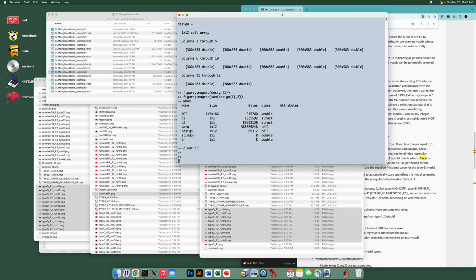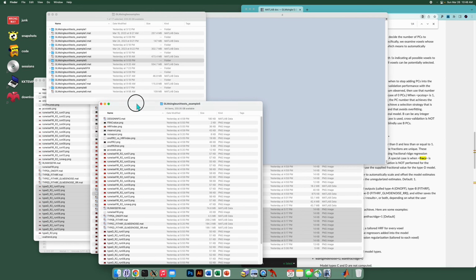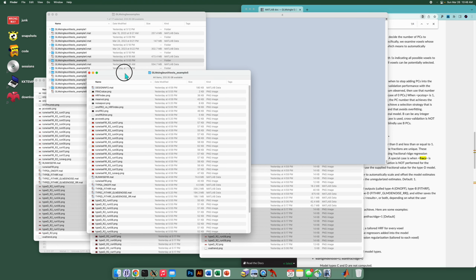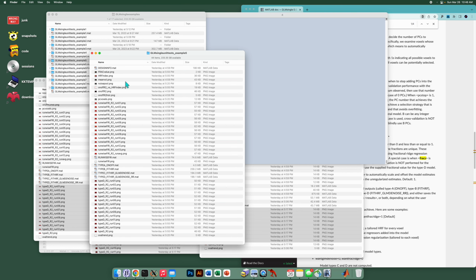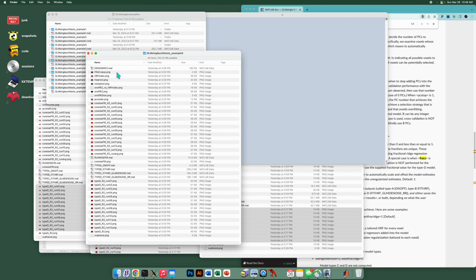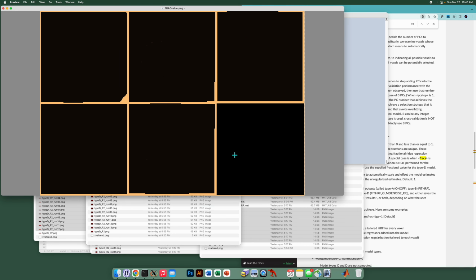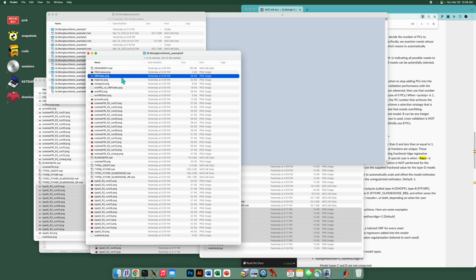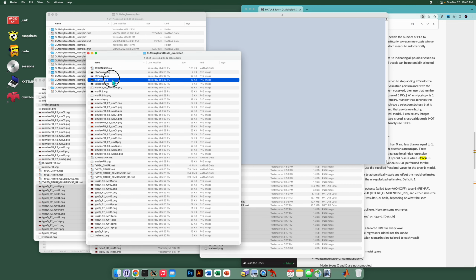Let's clear this. So there's one example data set I have here that actually doesn't look very good. In fact, it looks like something's completely wrong. And I think this is instructive as an example. So this is example 5 here. If I pull up frac value, I don't see anything but black, which highly suggests there's no signal that it detected. Href index is hard to look at, but it doesn't look very structured.